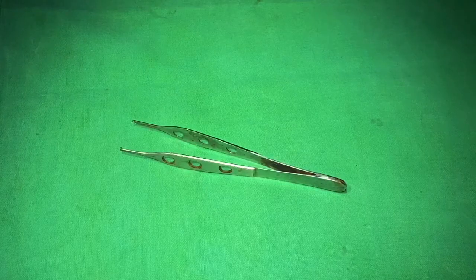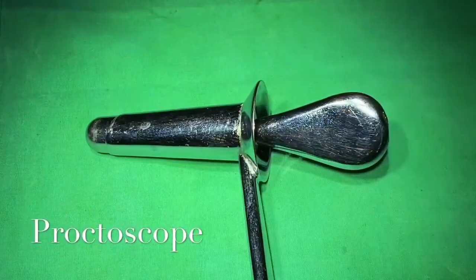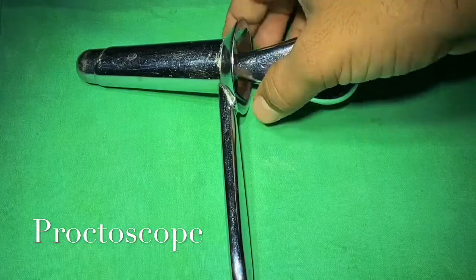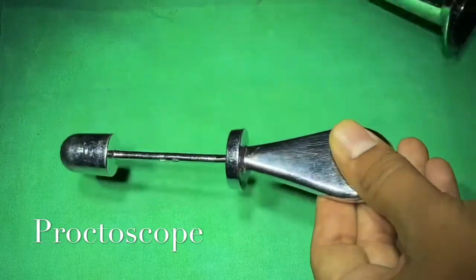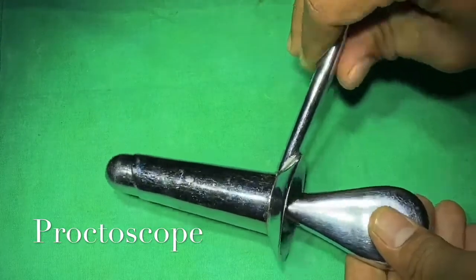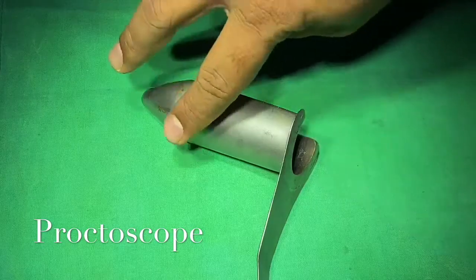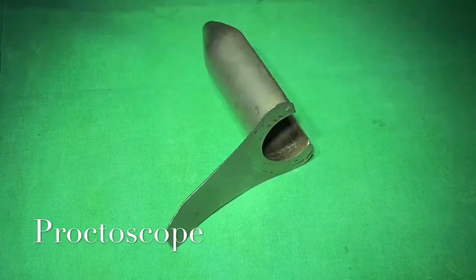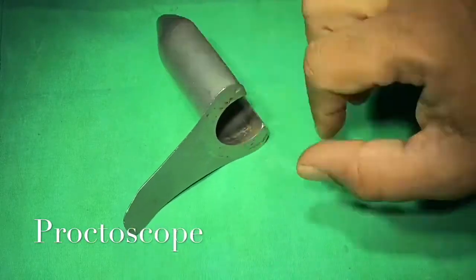This is Addison's dissecting forceps; because of multiple holes in the body, the weight of the instrument is reduced. This is a proctoscope, used for anal examination or anal surgery. It consists of an outer proctoscope and an inner obturator. Another type is the slit proctoscope, which has a slit on one end and a closed tip, used for hemorrhoidectomy or anal surgery.